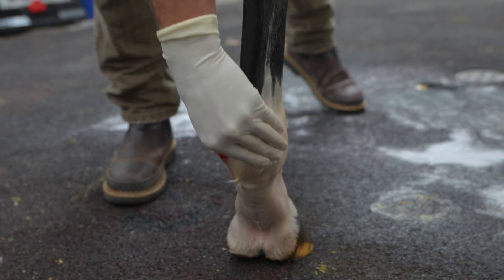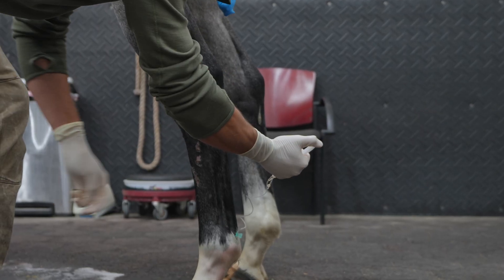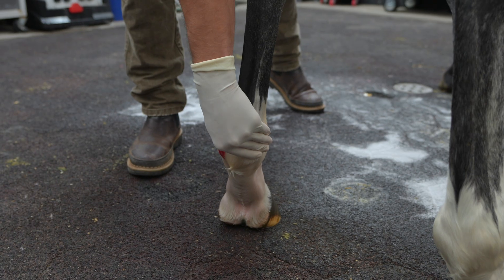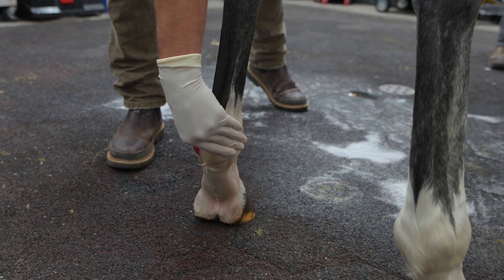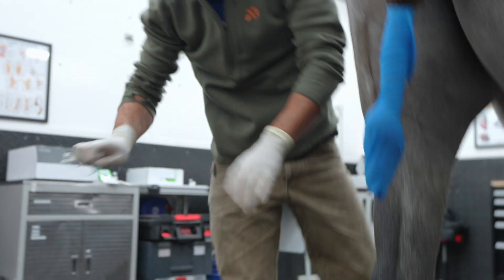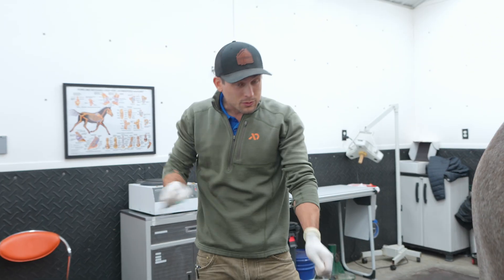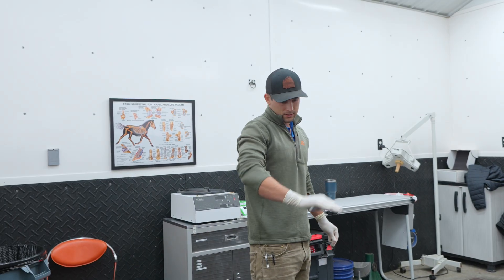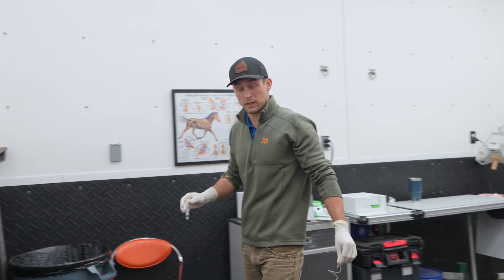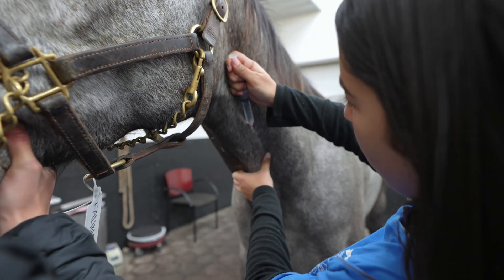What we're doing is just blocking that foot before the actual injection with the PRP. I like them to hold nice and still so I can take my time to get into the joint and make sure the treatment goes perfectly — make sure I don't get kicked. I find blocking the foot before anything else is really good, and then everything else goes quite smoothly.